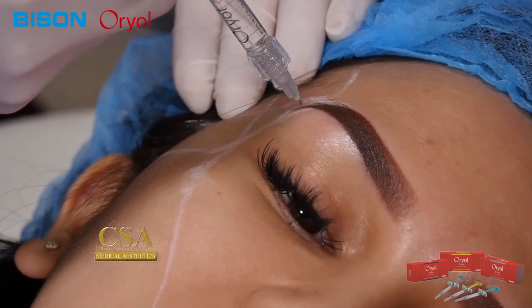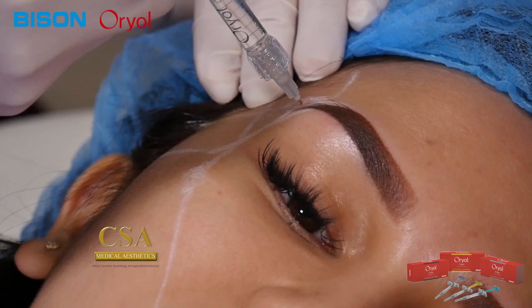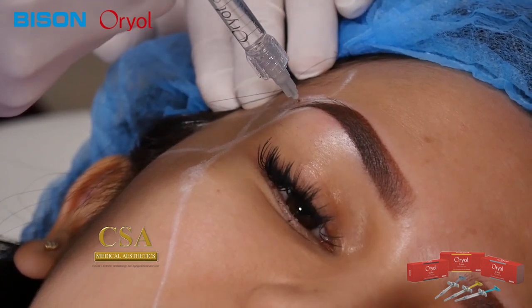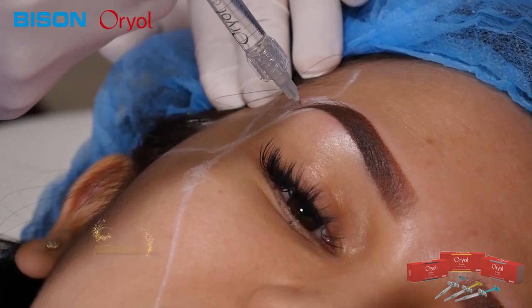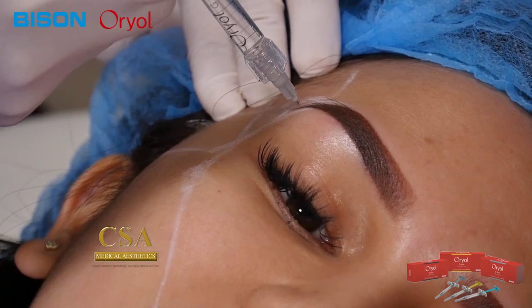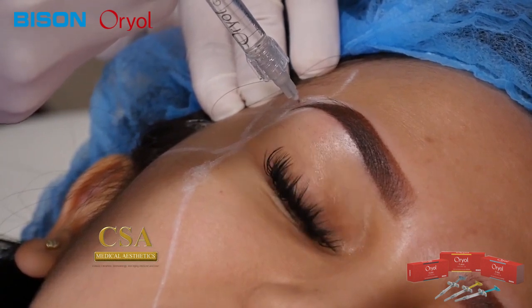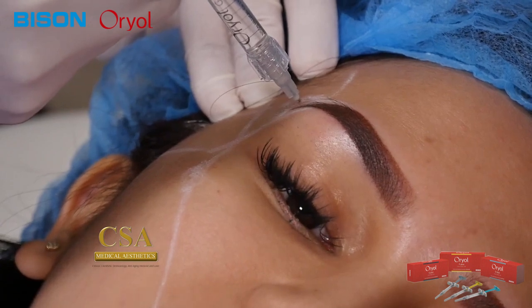Actually, here the superficial temporal blood vessel is palpated near the hairline region. That's the normal position of the STA here. And actually, I am palpating that pulsation over here with my non-injecting hand. And I'm already pushing, and I want to fill in about 0.5 ml of my product here.